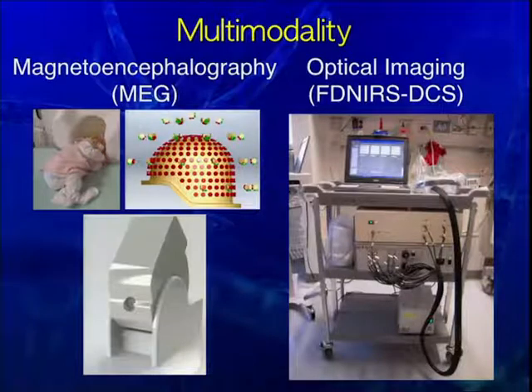But MR alone will probably not be enough. It only sees certain aspects of what's going on. I think we'll always be using complementary NIRS systems, and Canon is starting to commercialize these. Dan and I are both involved in that venture, so hopefully there'll be some devices that are not so cumbersome and don't require a couple of postdocs in order to actually do them. This provides really relevant optical information.